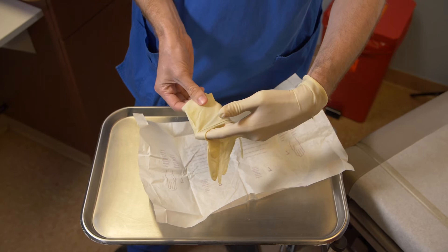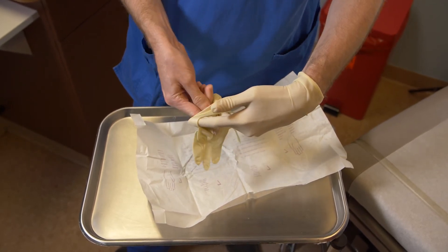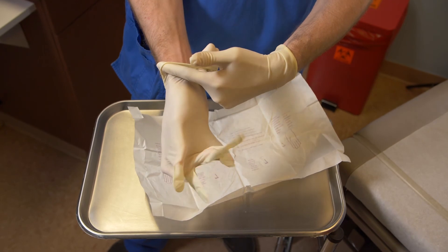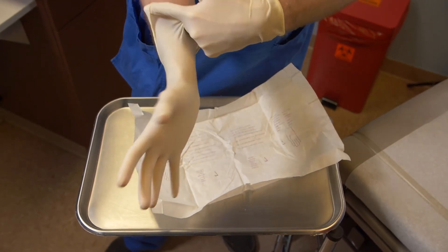Do not drag the glove across the package or allow it to touch any unsterile area. With the palm up, slip the second hand into the glove. Do not allow the outside of the gloves to touch non-sterile skin, and be especially mindful of the thumb. Adjust the gloves on the hands as needed, but avoid touching the wrist area. Keep gloved hands above the waist and away from the body, and do not touch non-sterile surfaces with your gloved hands.